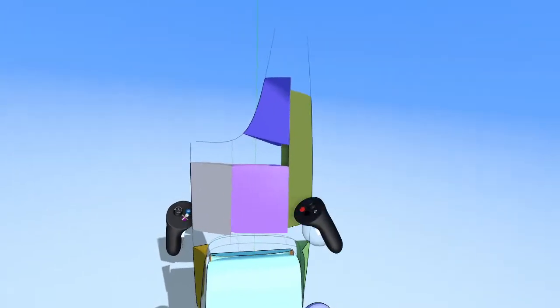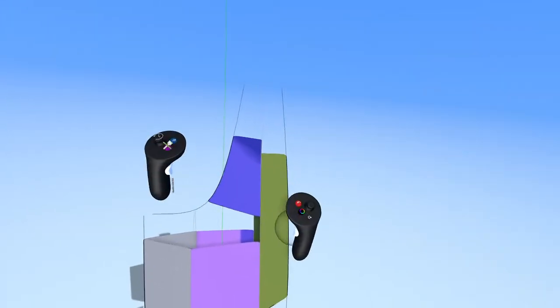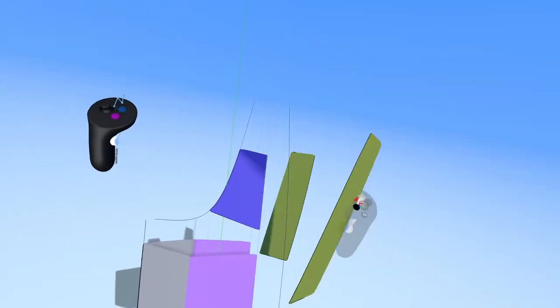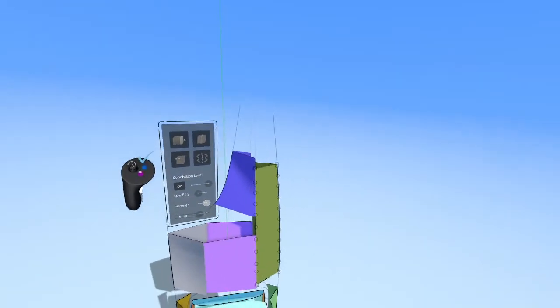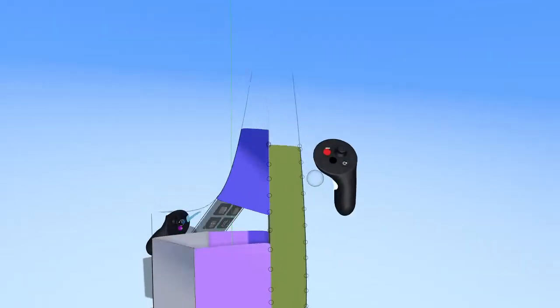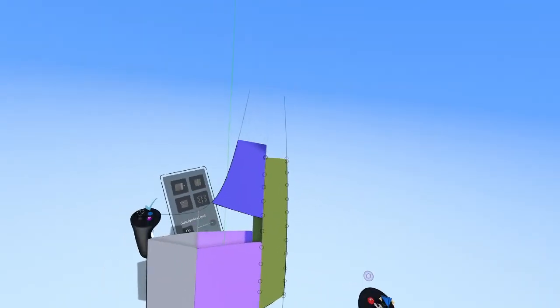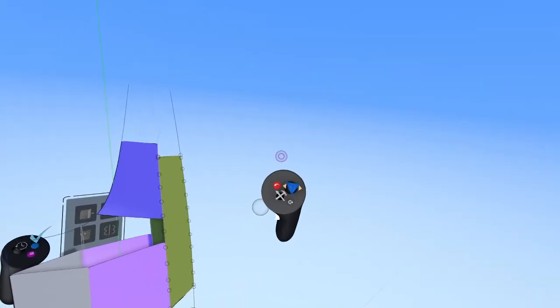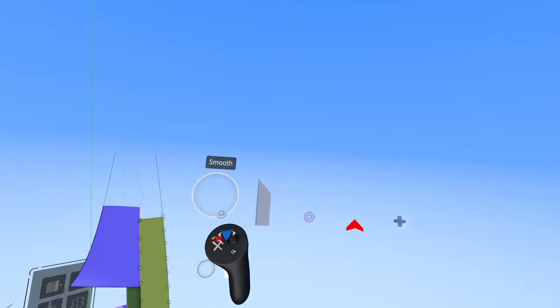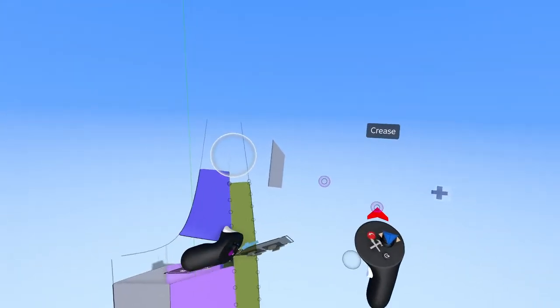All right, cool. So let's do that with these surfaces here. Let's actually start connecting them together. To do that, you can grab a sub-D surface. Only a sub-D surface can do this. Put it into edit mode, and you'll notice that you're seeing the edit points for this surface, but not the other ones. That's because they're not merged together. To merge them together, press this hammer and brush icon, and you have these different tools that can be used only for sub-D geometry.